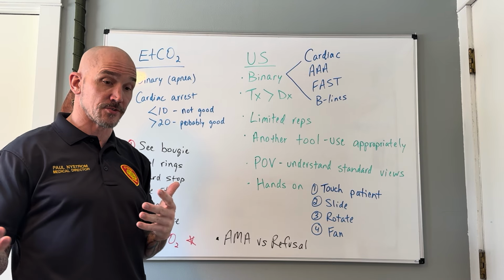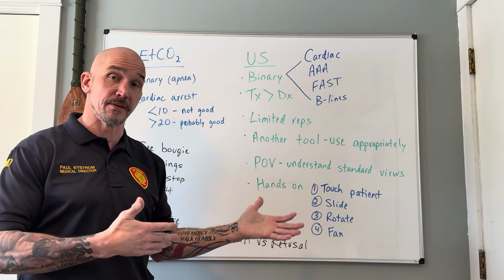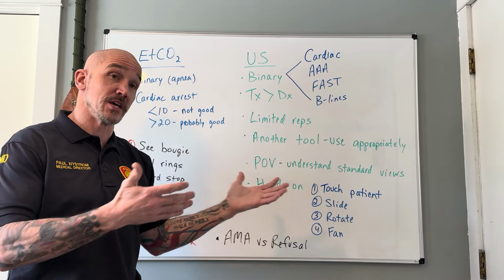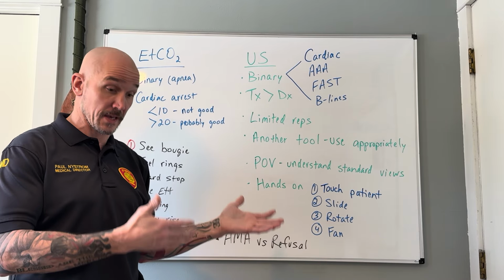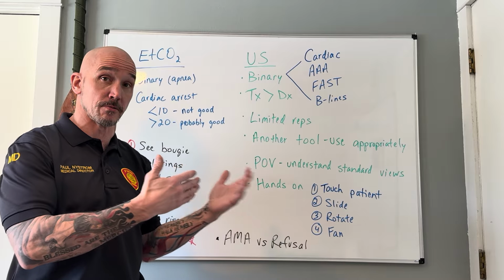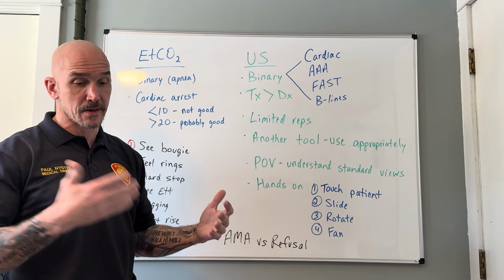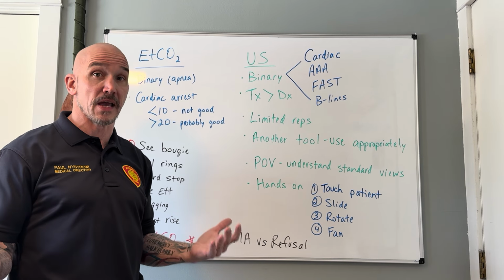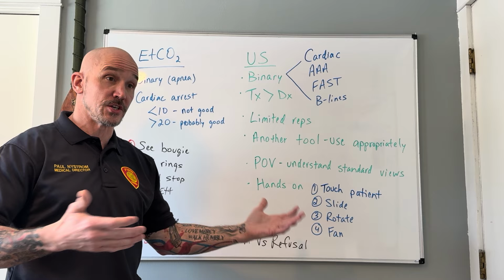In the same way, if you're doing a FAST exam, you're already going to Hennepin for a big trauma, maybe you don't need the FAST exam because you're already going there. Does it change things when you get there? If you can confirm with them, like, hey, I'm pretty sure I saw a positive FAST, it's going to change what they do when you convey that information. Conversely, if you're going to Southdale for somebody who seemed like relatively minor trauma and they have a positive FAST, okay, that may change your destination.